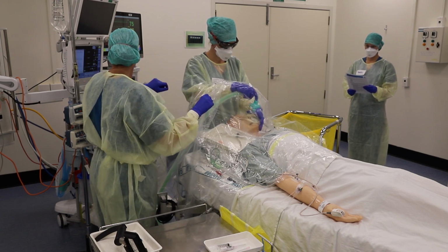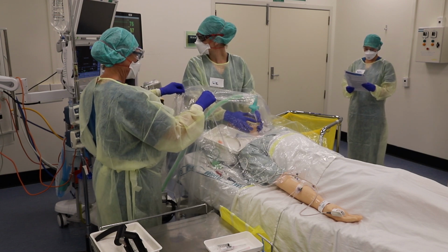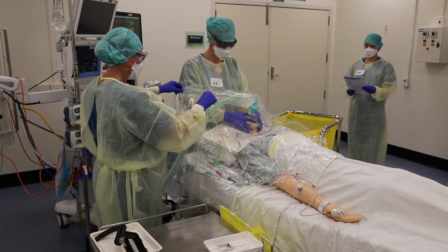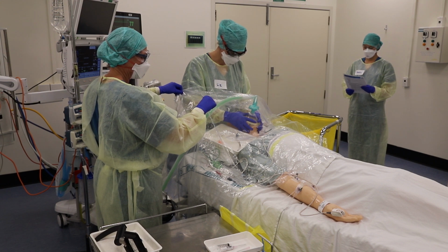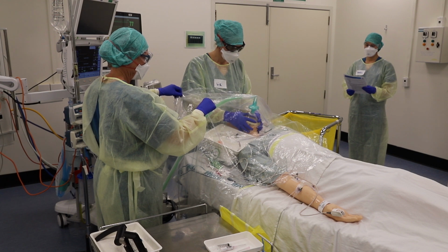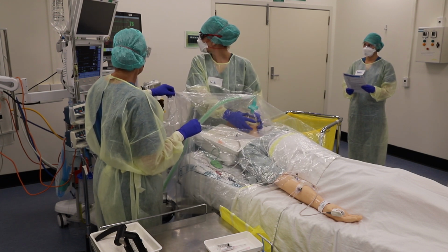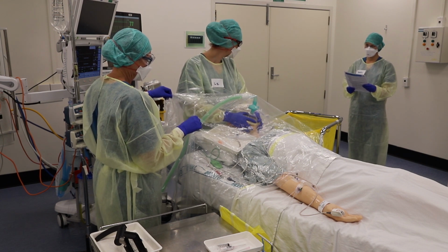Okay, so we're extubated and I've got the oxygen mask on. Face mask is held in place and the patient's respiratory status is assessed. Just breathe in and out, Simon. Everything's gone very well. Looks like he's breathing well there. What do you think? Good trace up there. All right, looks like he's doing well there, Celine.